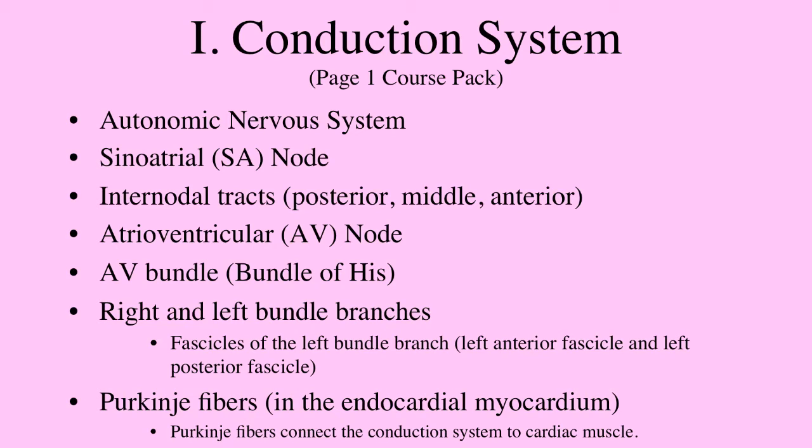So you have an electrical message and then a heart contraction following the electrical message. The electrical message is the EKG. And so you'll see the different waves and information that are occurring, and from these waves on this electrical message we can determine all kinds of things about the EKG, including things like axis that you'll learn about, rotation, myocardial infarction, dysrhythmias, a lot of different things that are coming up throughout the course. So that's a summary of the first slide.